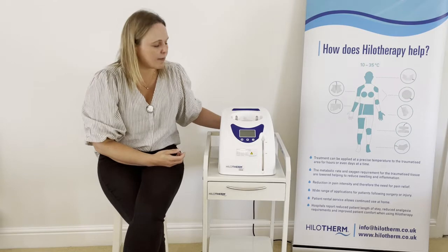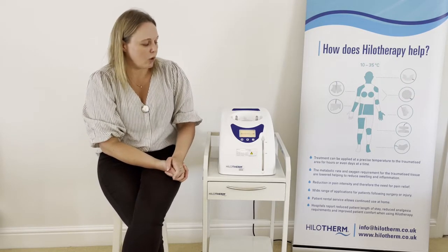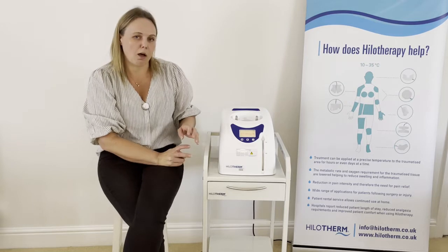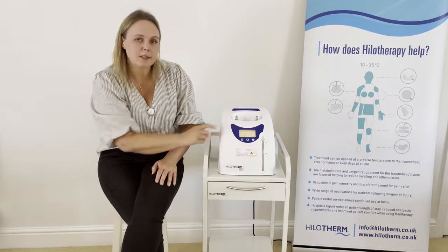I'm just going to turn the device on now. When you first turn the device on, you can see that there are two different temperatures listed on the display: an actual temperature and a nominal temperature. The only thing that you can adjust is the nominal temperature.